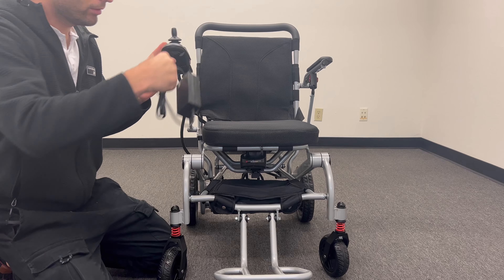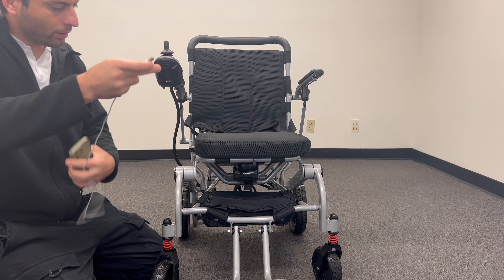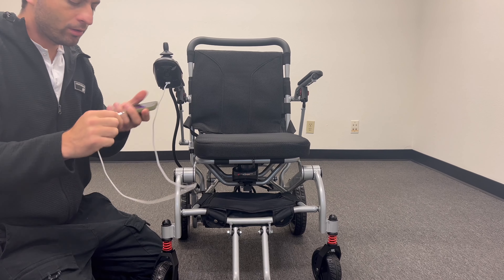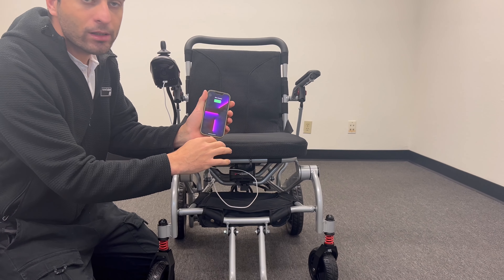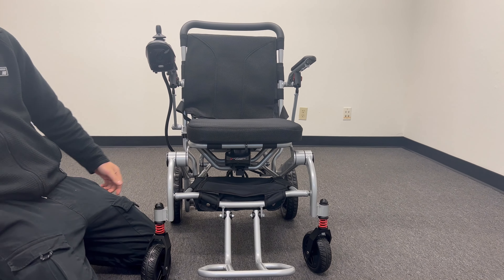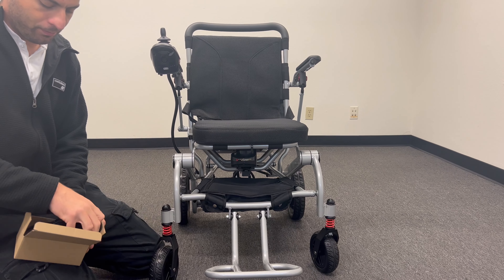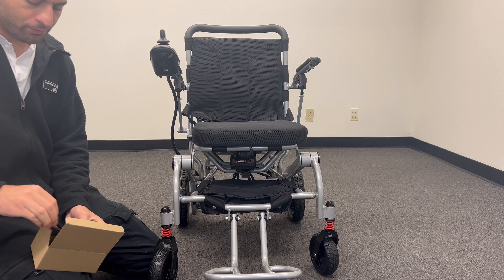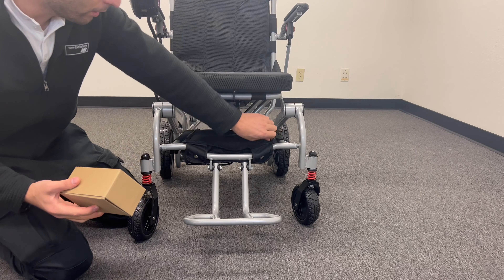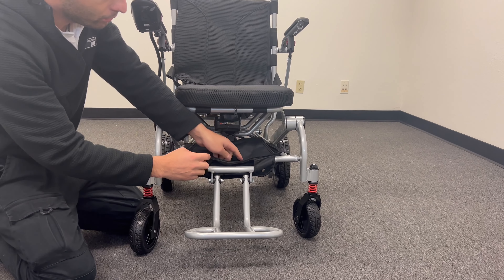The second thing — the best feature you will have — you can charge your phone as well, right here. You can charge your phone whenever you need it. And if you want to carry your charger or any other stuff, wherever you go, you can put it in the bag at the bottom right here and carry it.